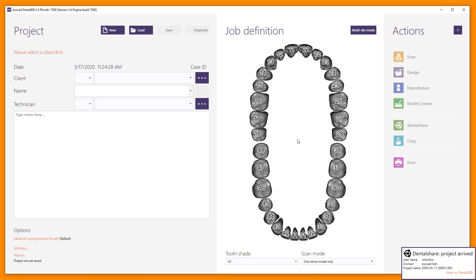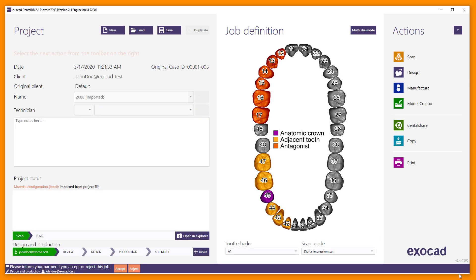After the download of a dataset is completed, a notification appears in the bottom right corner of the screen. It informs you about the download completion and shows project details. You can directly view the project in the DentalDB by clicking on View in DentalDB. All new projects automatically get added to your DentalDB load list.